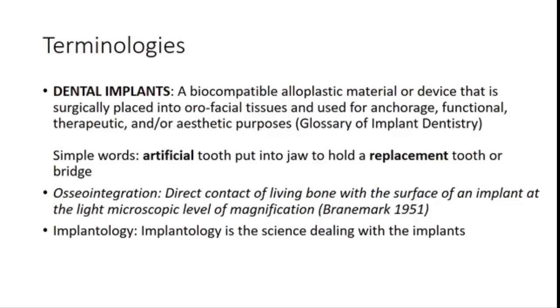In simple words, it is an artificial tooth put into the jaw to hold a replacement tooth or bridge.